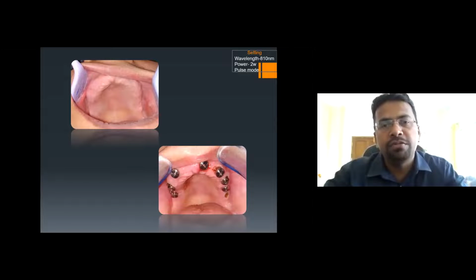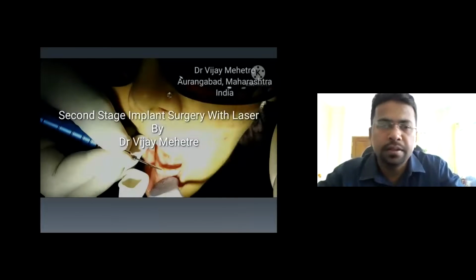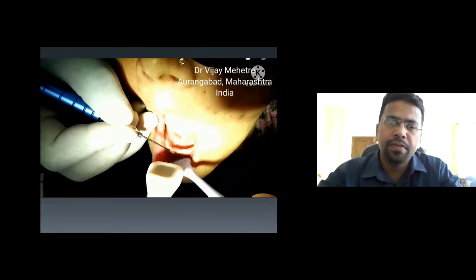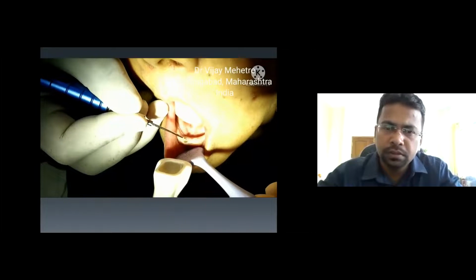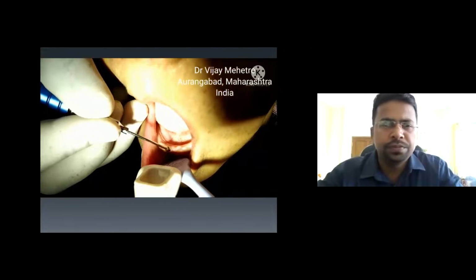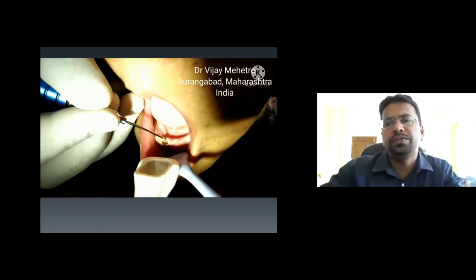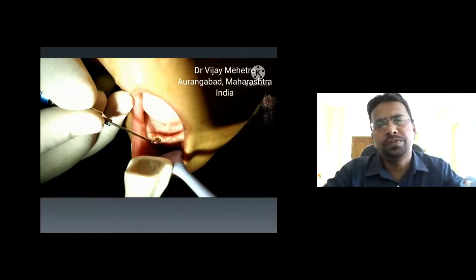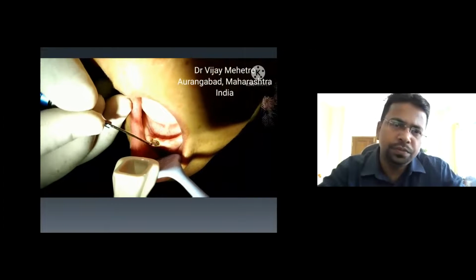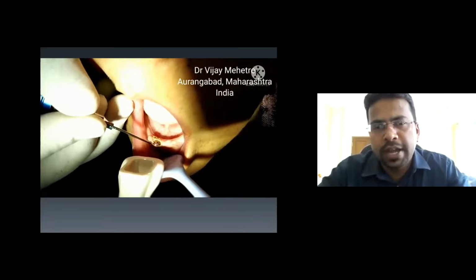Let's see a video of the second stage implant surgery. You can see the crown cover screw is exposed now.